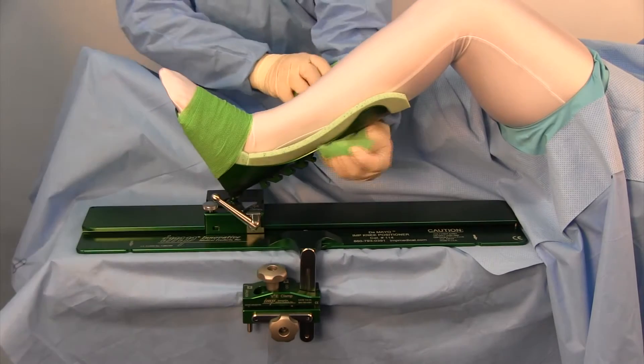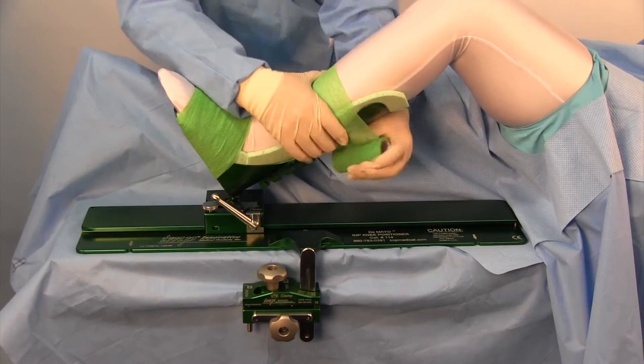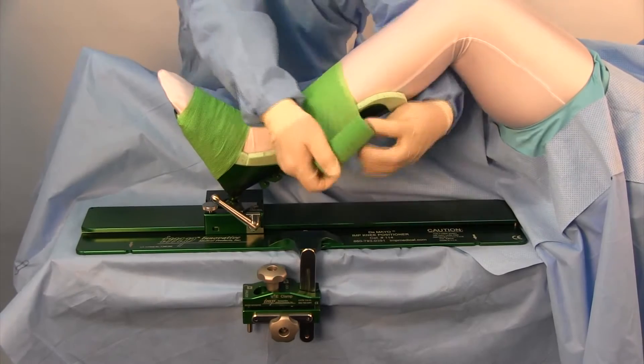Then wrap the calf of the patient, being careful not to cover the block on the back of the boot if you are using the distractor.